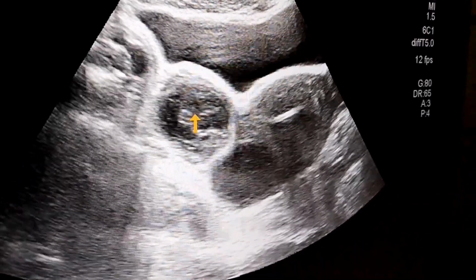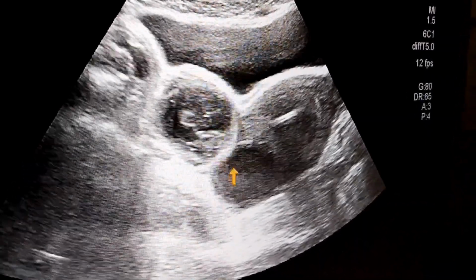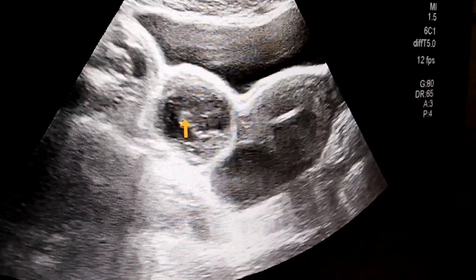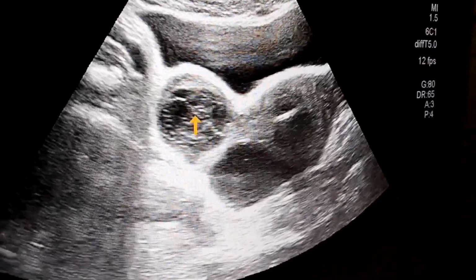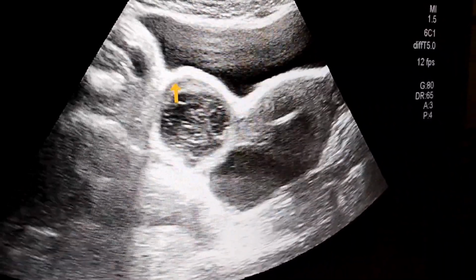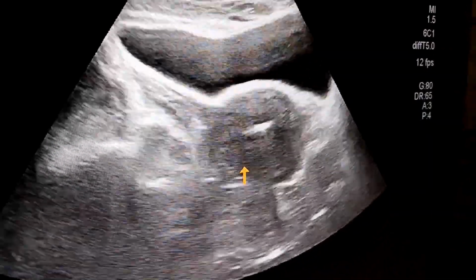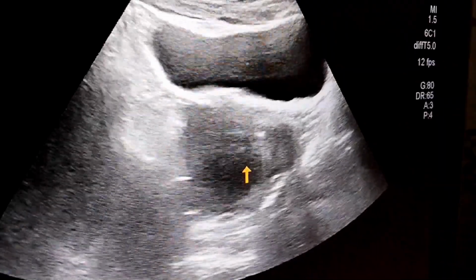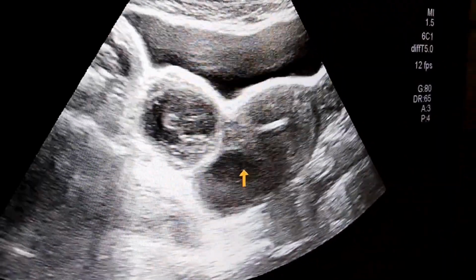We can see two hemorrhagic cysts with different appearances. This has the appearance of echogenic dot line, internal echo, thick wall, while this has the fluid debris level. So this was all about the right-sided hemorrhagic ovarian cyst.